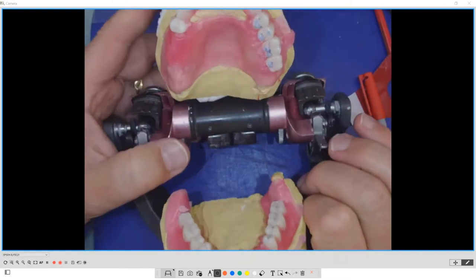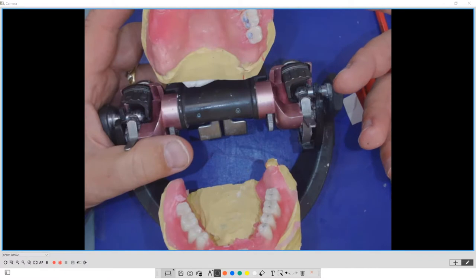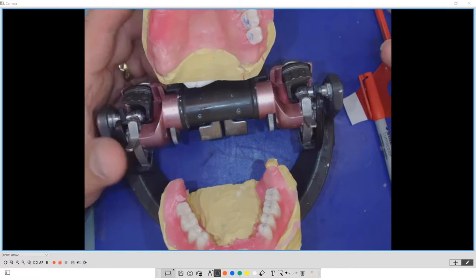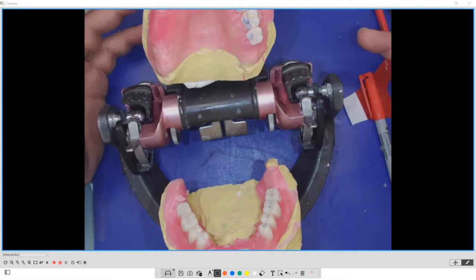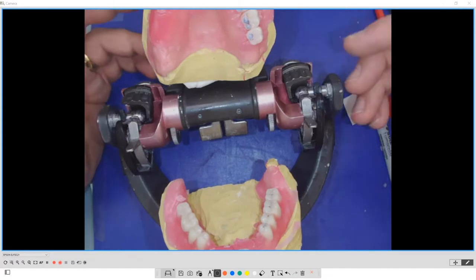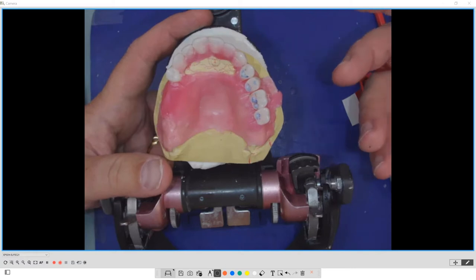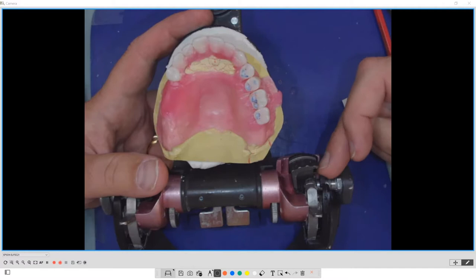Unless you take measuring tools to measure a condylar angle, which we can do conventionally, it's hard to do. You can do that with graphs and pantographs and functional wax rims and such. You can get a Digma, which is the digital jaw analyzer from Kavo. I know there are some other products coming to market as well that have the ability to start measuring condylar angle.